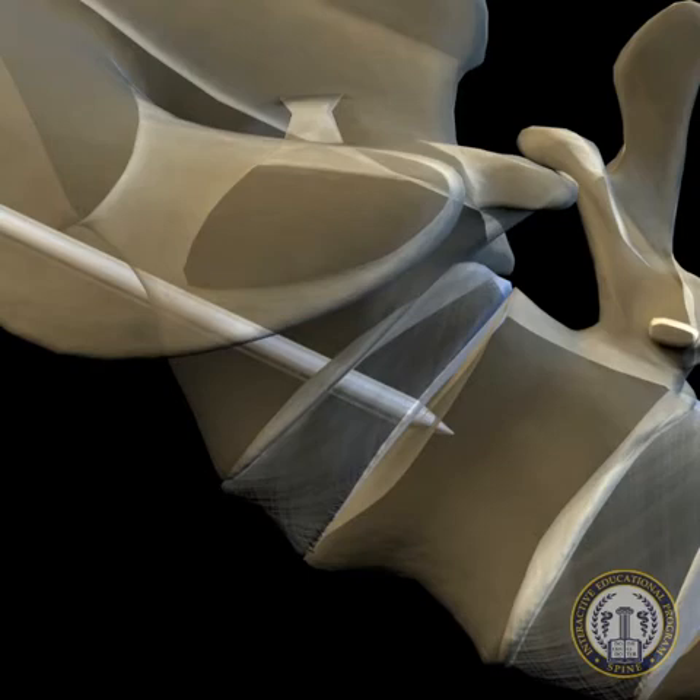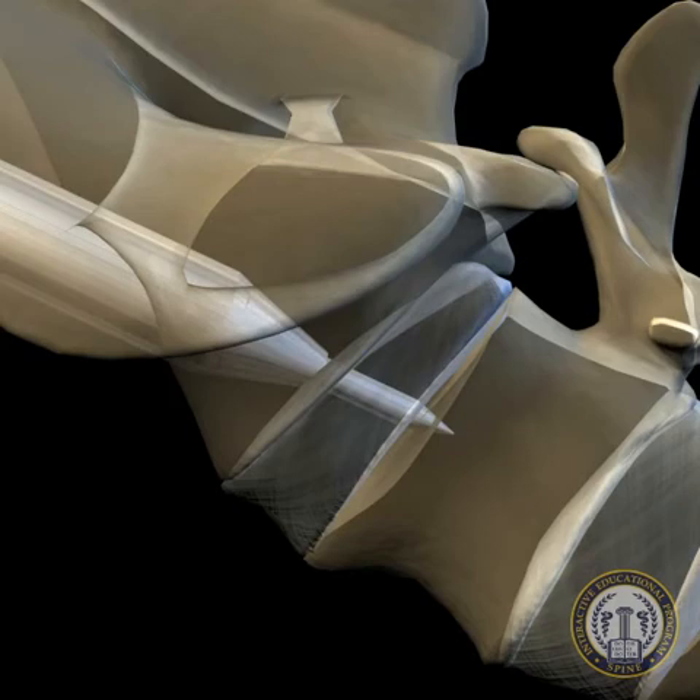Once this has been assured, a series of cannulated dilators is used to sequentially dilate the soft tissue and sacral corticocancellous bone to create a working channel into the L5 to S1 disc space. A working trocar is delivered on the outer diameter of the largest dilator and placed into the sacrum to allow for the planned procedure. This working channel must be placed sufficiently deep into the sacrum to allow absolute confidence that it will be maintained and prohibit any soft tissue from escaping into the operating channel.